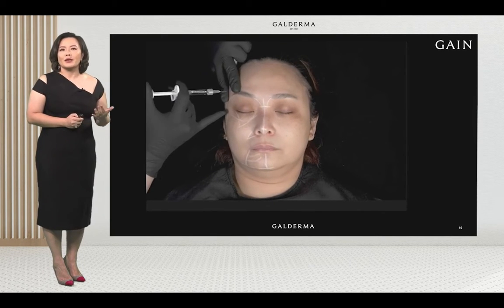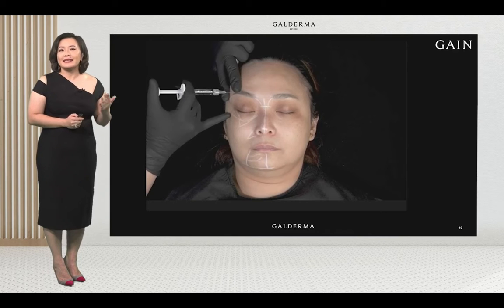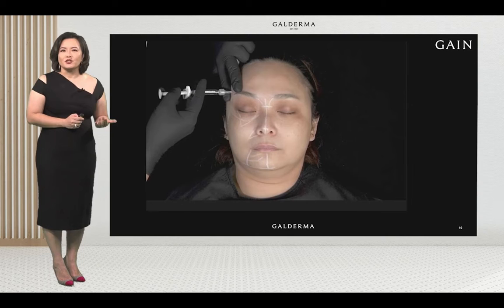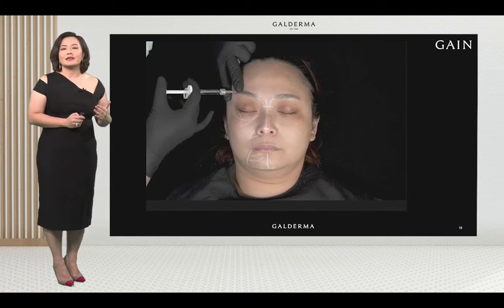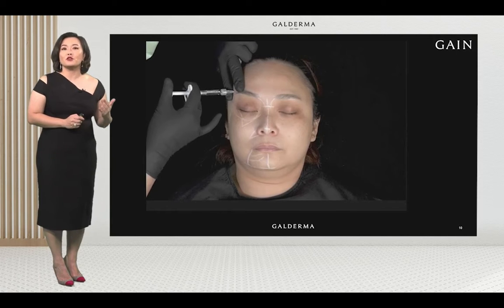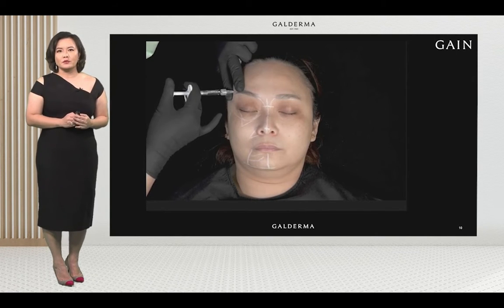When I inject with Lift, it is exactly the way I would do it with Volume. My injection point is 1 centimeter behind the temple crest and 1 centimeter above the lateral eyebrow. Remember to aspirate before you inject, but keep in mind also that a negative aspiration doesn't necessarily mean that you're not in the blood vessel.